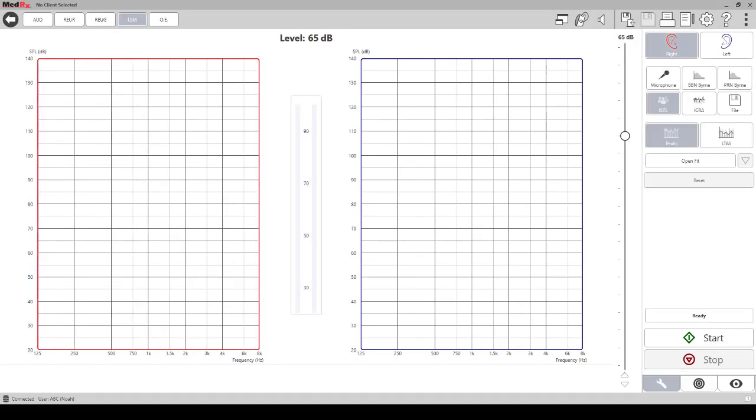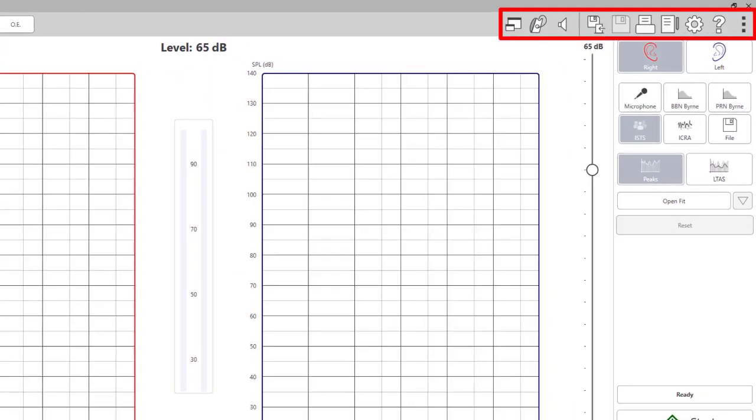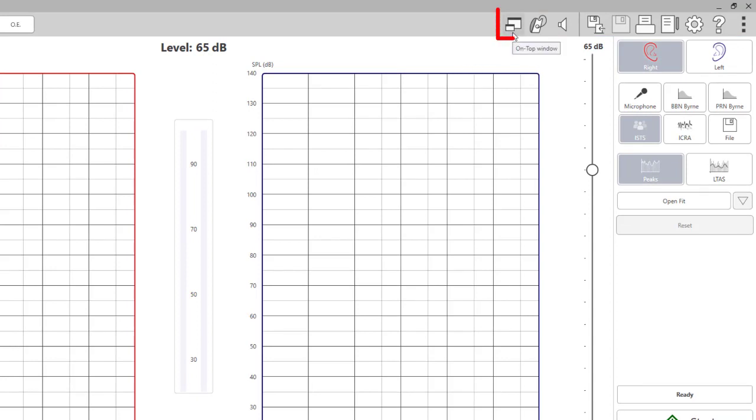Go to the icons in the top right corner. The first icon is to use the on top mode. This option allows you to overlay or place the LSM measurement screen on top of your fitting software. This will enable you to easily measure and adjust fittings on the same screen.